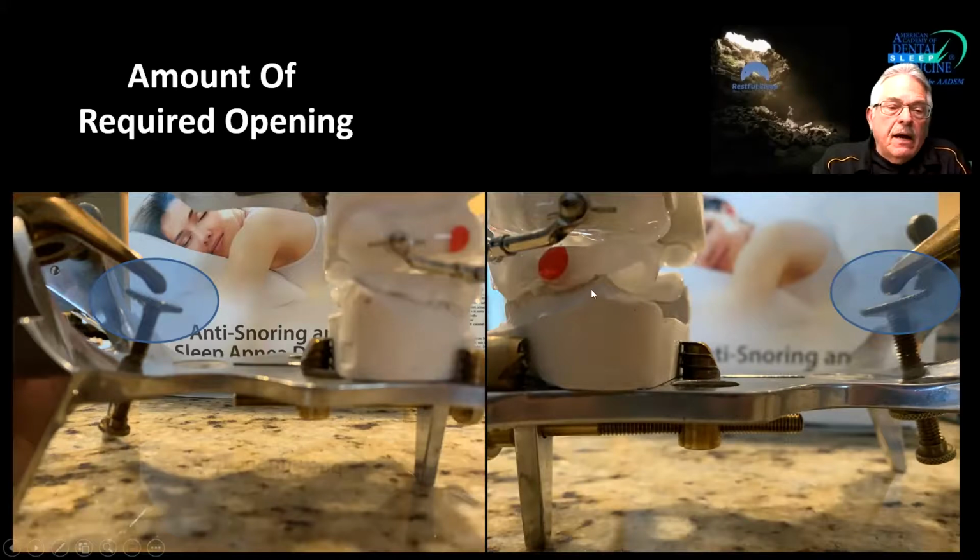I've never delivered one of these and had the patient say, this feels like it's open more than it was at the bite registration. I mean, nobody's ever said that to me. No patient has ever said to me, this is open too far. And don't get me wrong, I try to minimize that, but I also try to let the lab do what they need to do so they're happy with what they accomplish, and I simply protect the whole thing with an anterior midpoint stop.